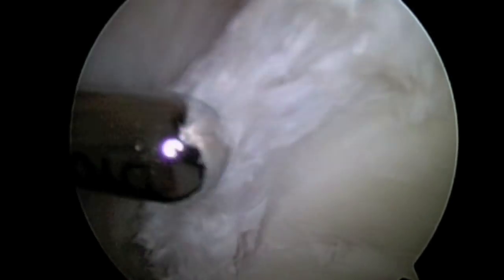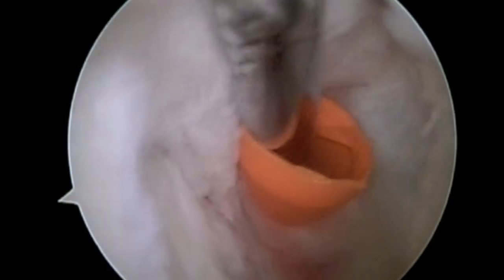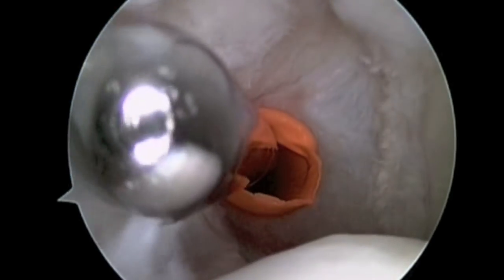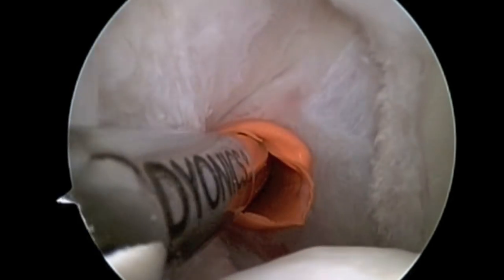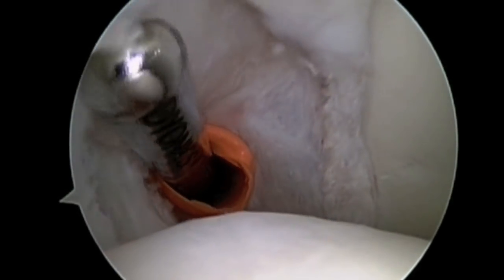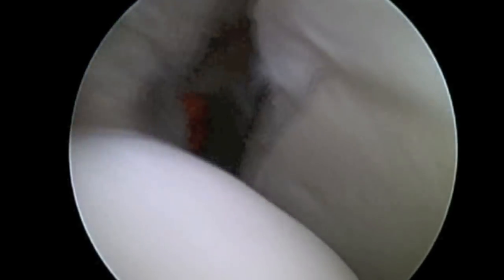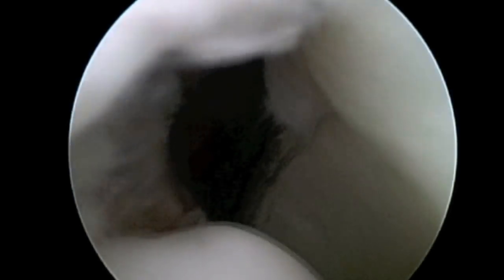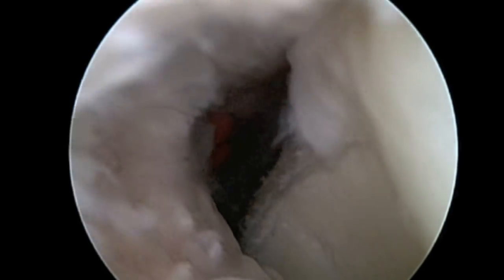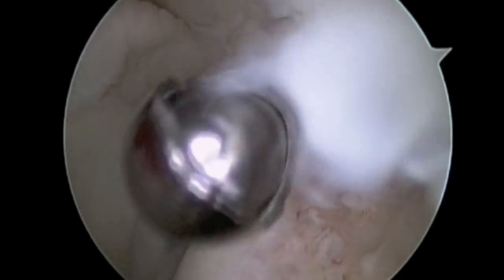Because these tears are not repairable, they are debrided. These are stable tears. Debridement involves removing abnormal tissue. We now see that the labrum and the partial tear of the rotator cuff have been debrided, and we complete the debridement from the front of the shoulder.